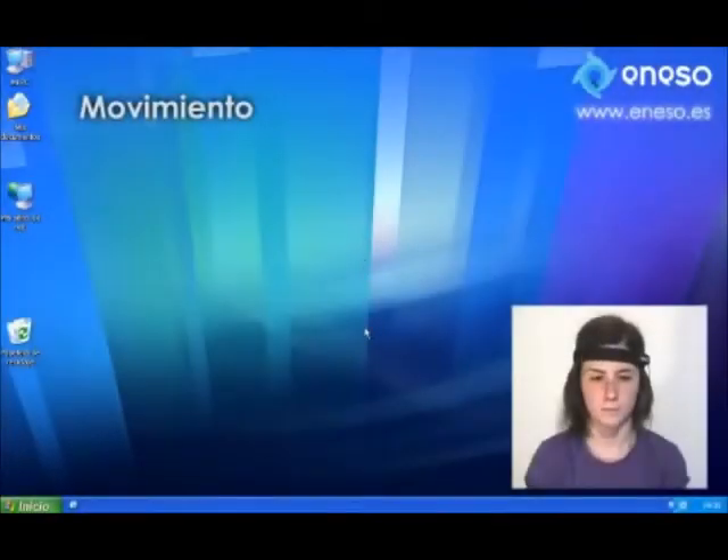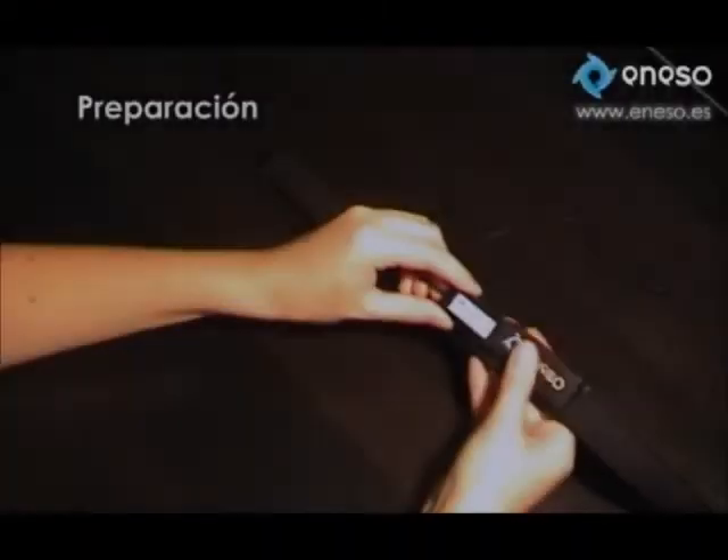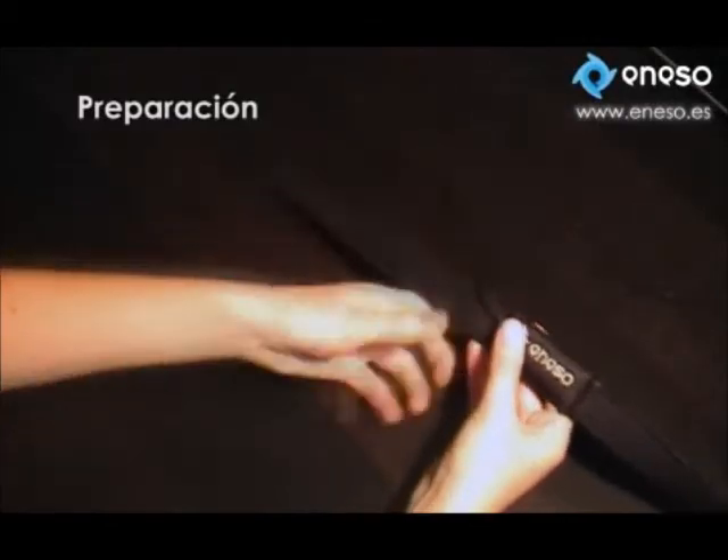Empathia is a commercially available product that allows people with reduced mobility to control a computer. We use Freescale's 3-axis accelerometers to sense the user's body movements.